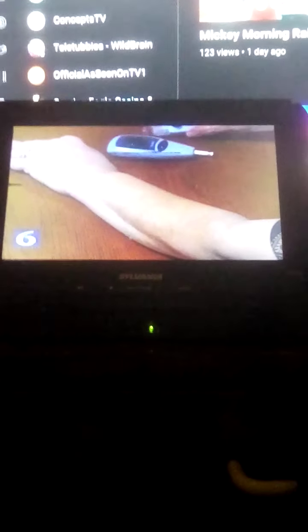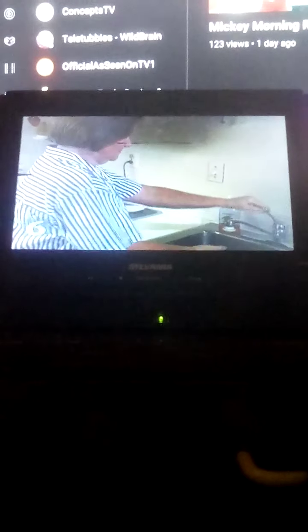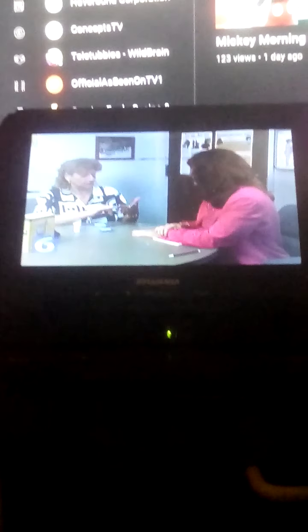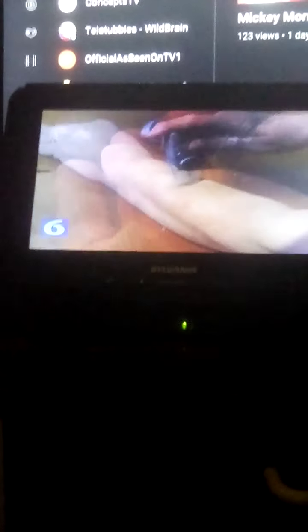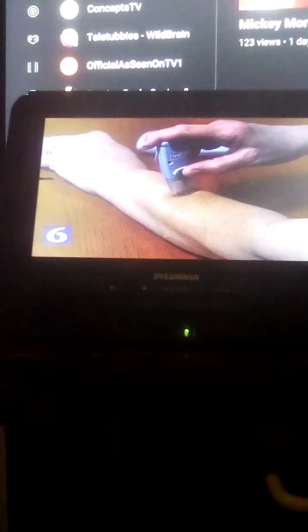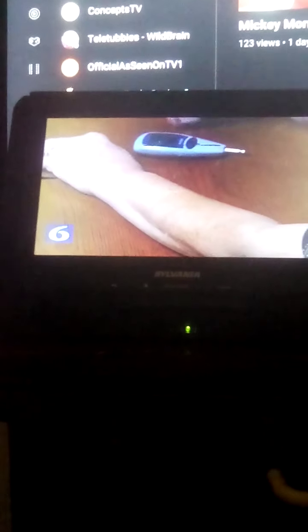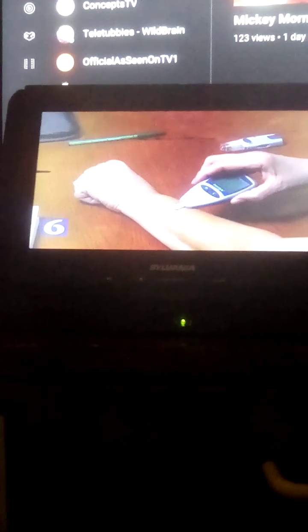If you are using your arm, gently rub the area. Washing your site with warm water and drying the area will also help in getting a good drop of blood for checking. Change your lancing site so your skin has a chance to heal. Use the side of your finger instead of the pad, because this part bleeds easily and doesn't hurt as much. If you are using your arm, hold the lancing device in place after you lance until you see a drop of blood form. Then place a drop of blood on the test strip.